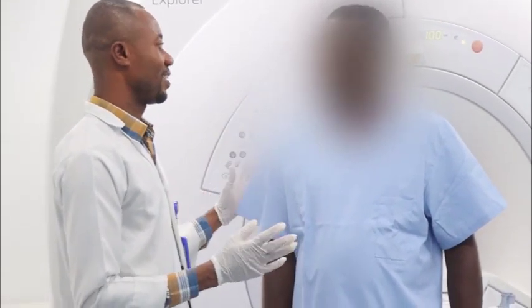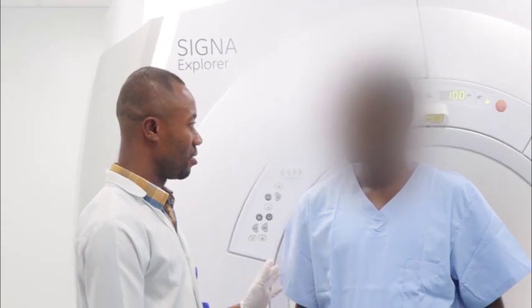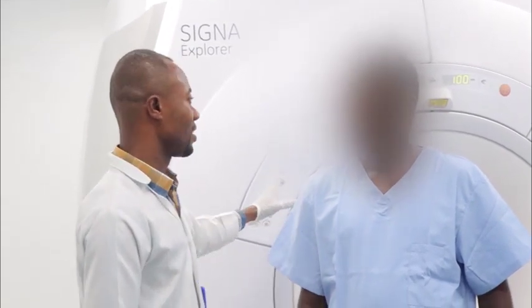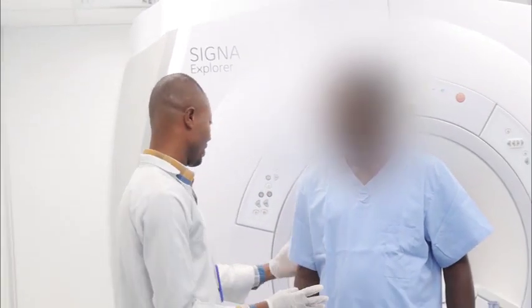While you are having a constant headache. Okay? So this is a painless procedure. It's not painful. But when you get inside, you will just be hearing the sound of the machine. Don't be scared, okay?